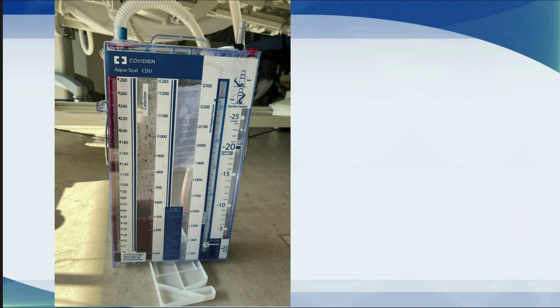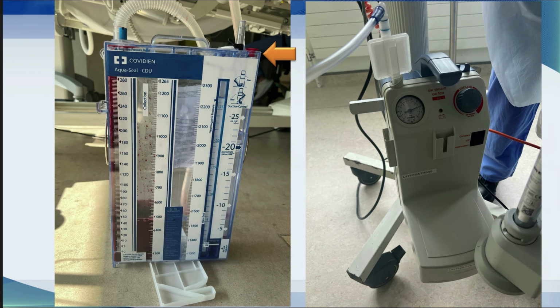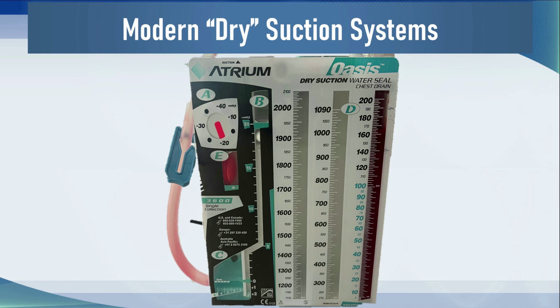This is a picture of a chest drain at the bedside of a patient. You can see that the suction control cap is on and the patient is not attached to suction. This is a portable suction machine. Now this is all very fiddly, so modern dry suction devices that cost a little bit more are available. This is one such device, and this has a switch that controls the maximum suctioning that can be applied to the patient without the need for a third bottle to be filled with water.